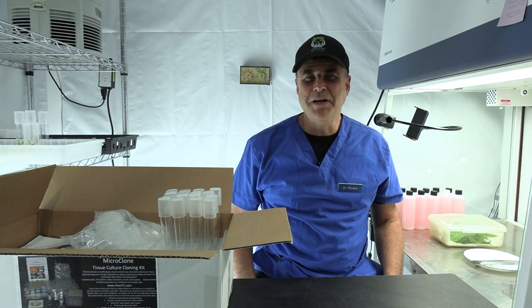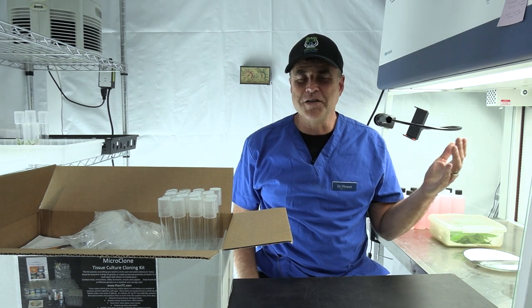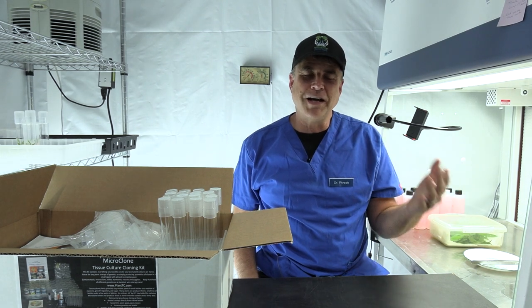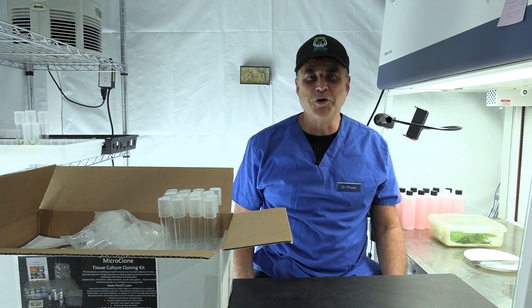How do you do? I'm Bill Graham, the maker of the MicroClone Tissue Culture Kit, and we're here at Monster Gardens to tell you all about how this easy-to-use kit is going to be your new indoor garden tool.